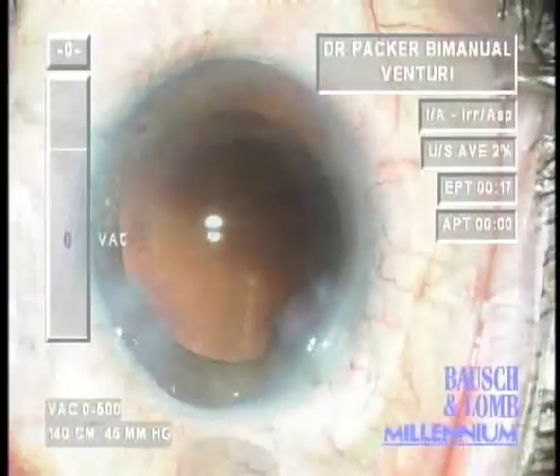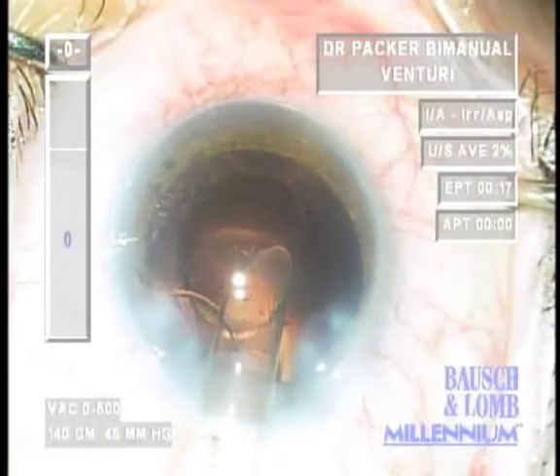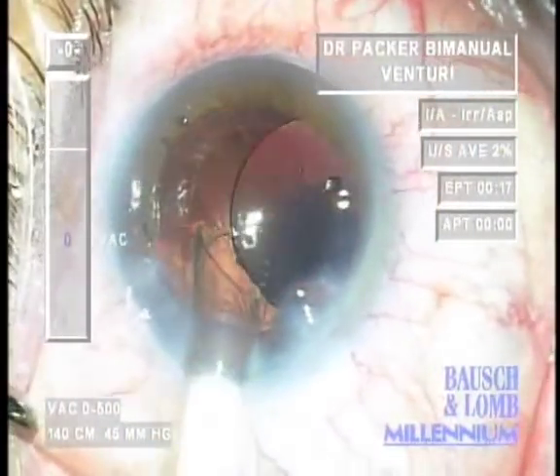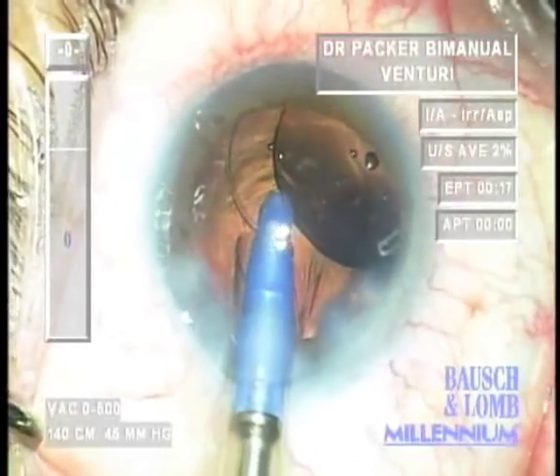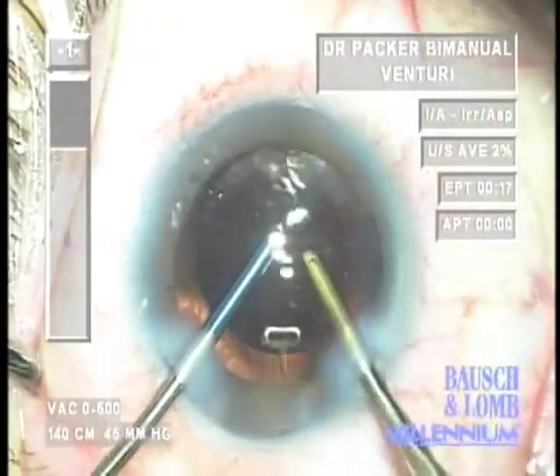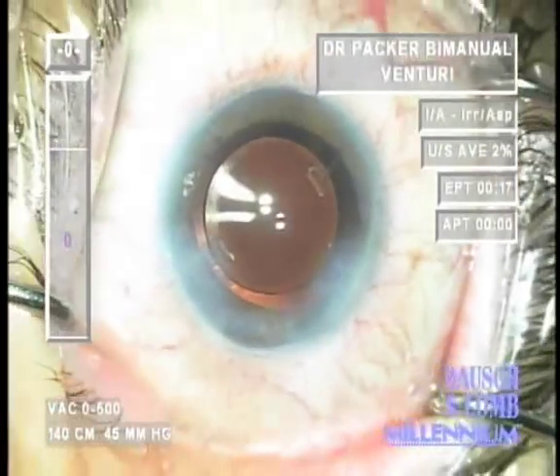A 2.8 mm temporal clear corneal incision is constructed and the intraocular lens is injected. In the United States, FDA-approved micro-incision lenses through sub-1.5 mm incisions are not yet available, though the work of colleagues in India, Europe, and Africa with these lenses is impressive. The trailing haptic Tecnis intraocular lens series can almost always be delivered with the plunger of the insertion cannula, and viscoelastic is removed using the bimanual technique. The temporal clear corneal incision seals beautifully, often without stromal hydration, though stromal hydration is considered an important adjunctive safety procedure for infection prophylaxis.